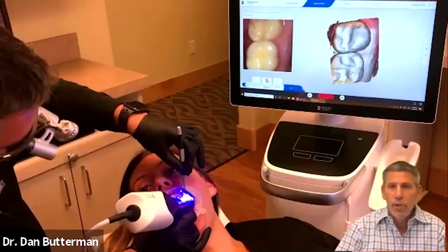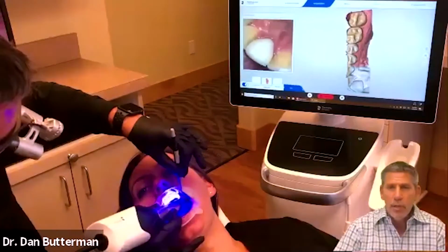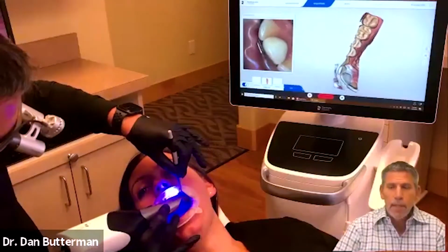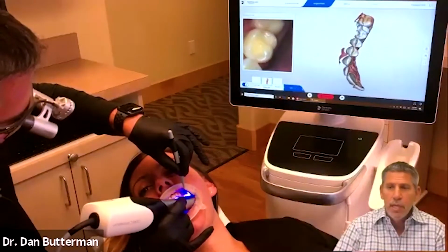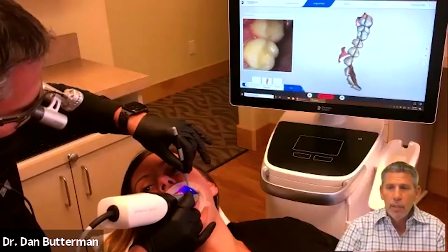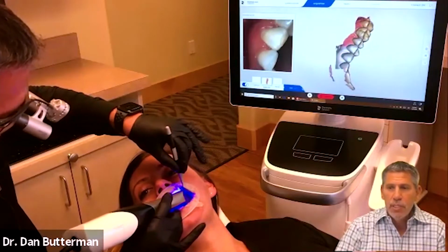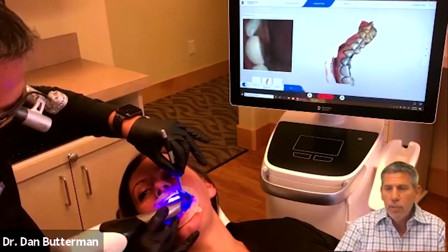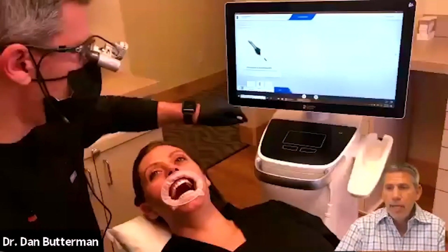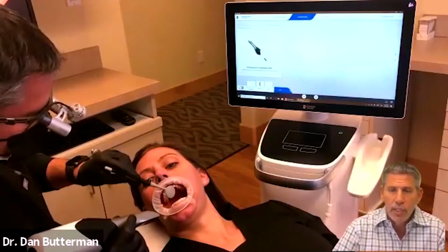So typically I'm going to do a linear scan technique, where I start on the occlusal, and then I roll around to the lingual, and then I come back along the occlusal surfaces of the teeth, and then we roll over to the buccal, and we fill in the buccal surface of the teeth. So this is acquiring live. And what you'll notice in a little bit when we do the lower arch is that it's going to be able to retrieve and remove artifacts as well that get in our way.